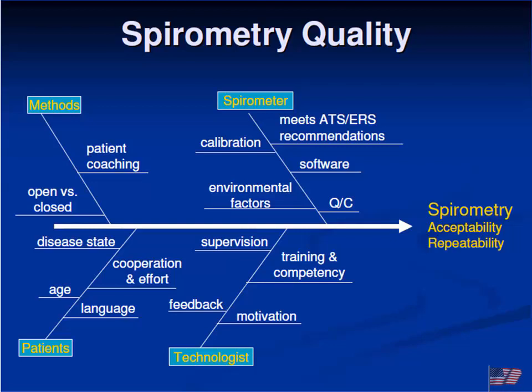Right? Some of the problem could also be us, or the person doing the testing. If they're not well trained, you're going to get garbage information. Believe me, I've gone to my family physician and said, can I have your medical assistant for about 10 minutes and I'll show them how to do a PFT correctly, because I've seen them do them and they're terrible because they're not trained correctly. When you're doing a pulmonary function, you have to yell at that patient.